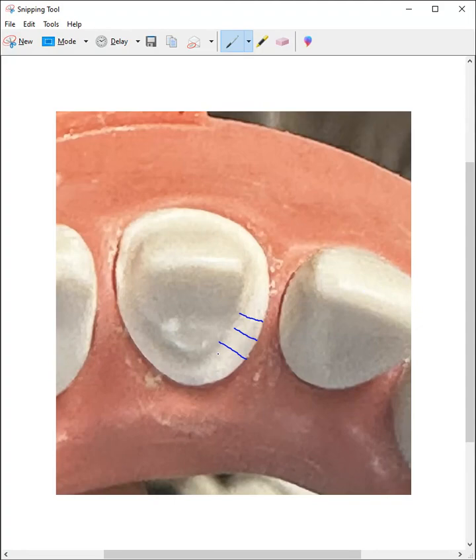You're definitely going to pass with this. Just small corrections: watch the width of this margin all along this side here, but overall really good, even margins all around. And then we looked at your incisal reduction — that might be a little bit over.